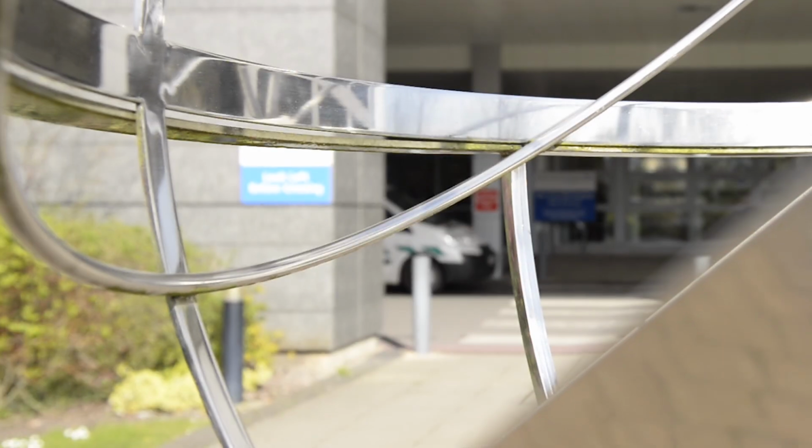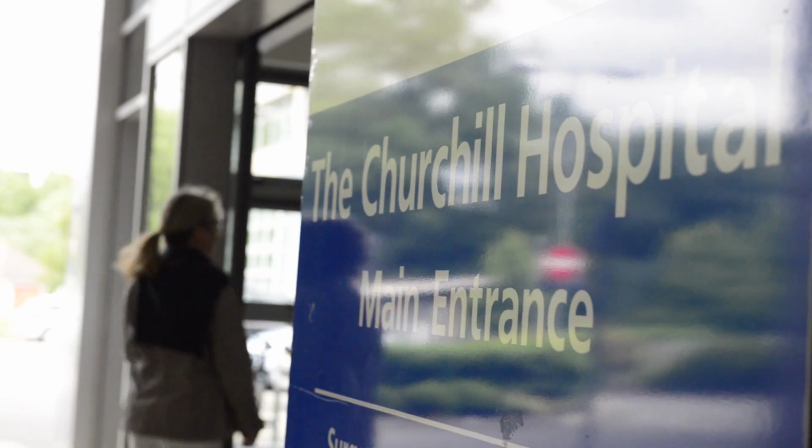Most of our patients will have 3 weeks of radiotherapy where they're given 5 sessions a week for 3 weeks, so a total of 15 sessions. We will have some people having an extra 1 week of radiotherapy afterwards, 5 sessions to the area where the cancer was if they haven't had a mastectomy.